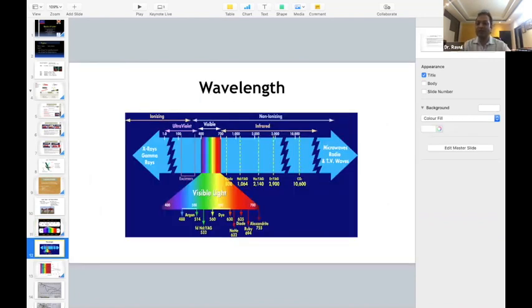If you look into this spectrum, it's a very, very important slide. In the visible light, you have a lot of lasers: argon, Nd:YAG 532, dye lasers, alexandrite, ruby, all those lasers. These lasers are all very superficial lasers, so they don't penetrate deep. The reason is because they have a shorter wavelength. So in the visible spectrum, all these lasers have shorter wavelengths, so they cannot penetrate deep.